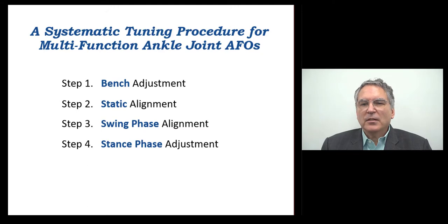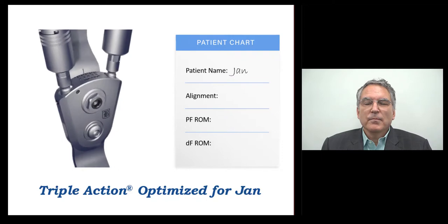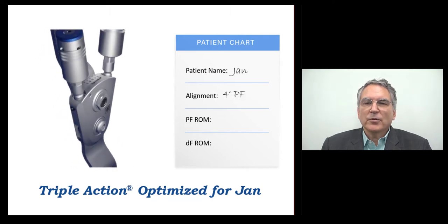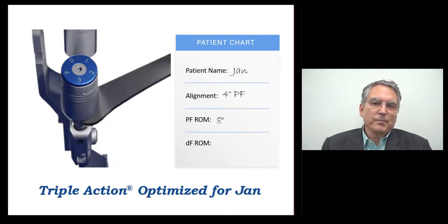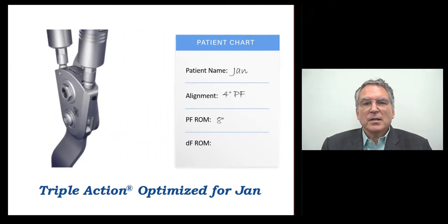Each step in this procedure defines explicit gait events, identifies gait deviations, and associates Triple Action adjustments to reduce those deviations. During static alignment, Jan's shank alignment was reclined to improve her standing balance while increasing her effective dorsiflexion range of motion. The final ankle alignment setting on the Triple Action was four degrees plantar flexion. Next, early stance phase was tuned to mobilize ankle motion in first rocker and reduce knee flexion from initial contact to loading response. The final plantar flexion range of motion setting was eight degrees. Lastly, dorsiflexion range of motion was increased to permit ankle motion in second rocker, which also decreased the resistance to dorsiflexion, reducing Jan's knee hyperextension after mid stance.